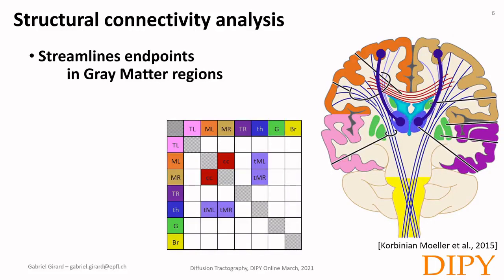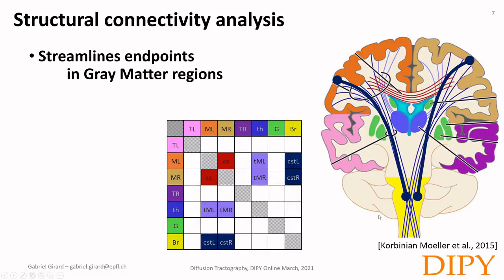We could also do the same for the other connections. We could use the thalamic connection to the motor left and motor right, and represent this in our matrix from those areas to that region. And finally, we can do the exact same for the corticospinal tract, which goes from the brainstem to those motor regions. This is a small example, but we can see that we now have a fully reconstructed matrix out of those streamlines and parcellation.